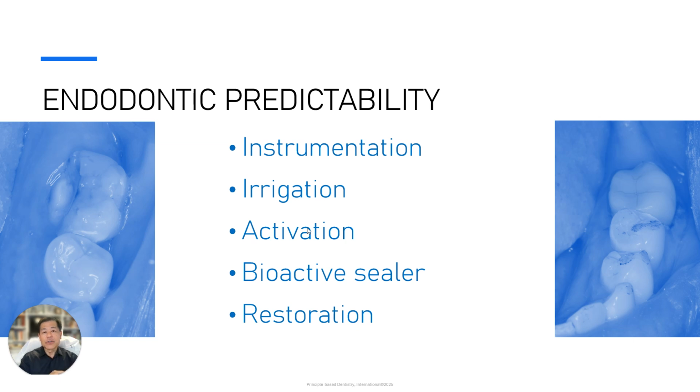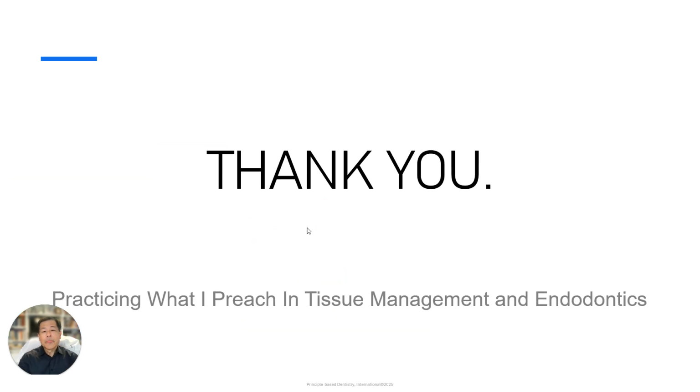And then we place the restoration. So everything is restored, like you see over here on the right-hand side. The patient came in with that large lingual side of that tooth fractured off, and on the right-hand side, you can see that now the root canal is done and the restoration is in place.